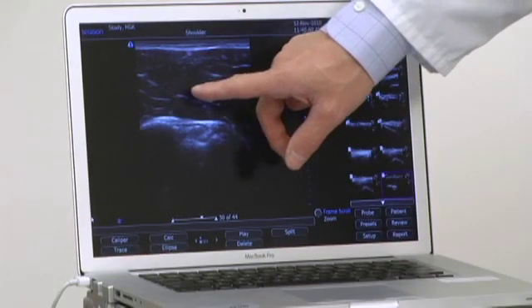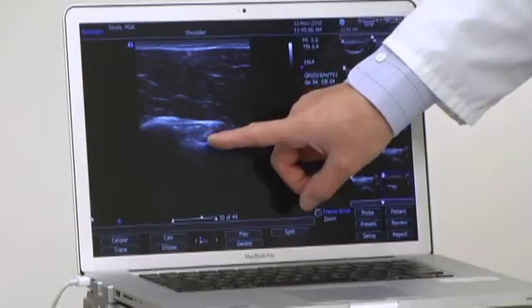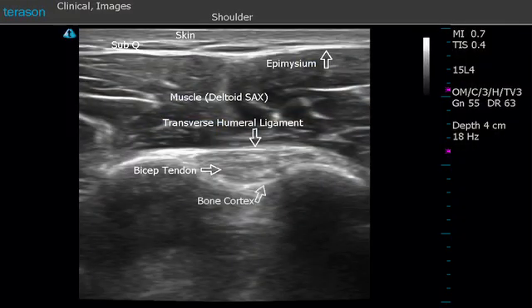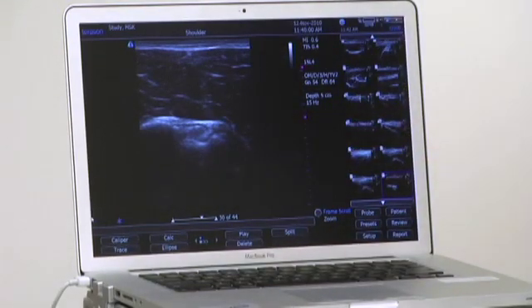That bright line we see here is actually the epimysium. Here we see the starry night appearance of muscle. Under that, we see the transverse humeral ligament, and deep to that is the biceps tendon. Here we see the bright echogenic structure of the bony cortex, and beneath that is shadowing or reverberation phenomena — not actually useful image below the cortex of the bone.